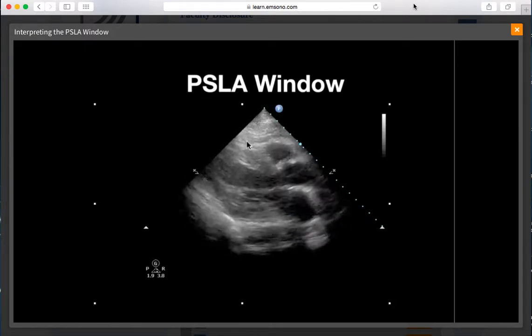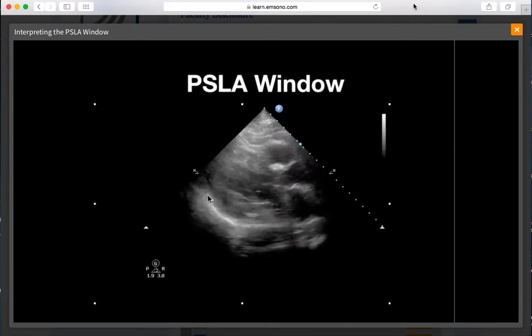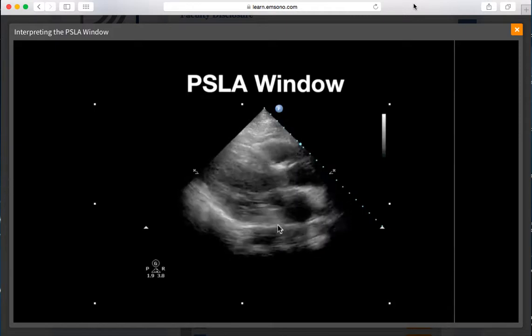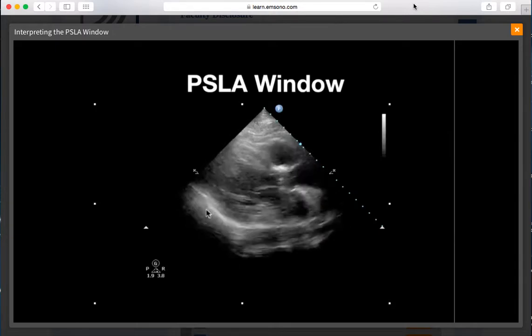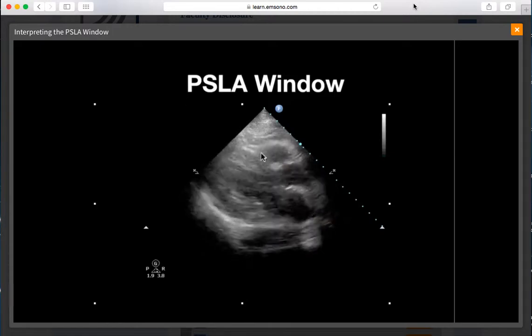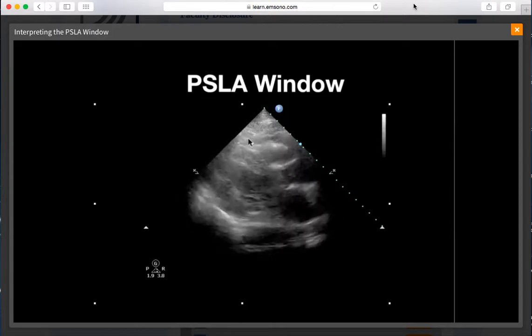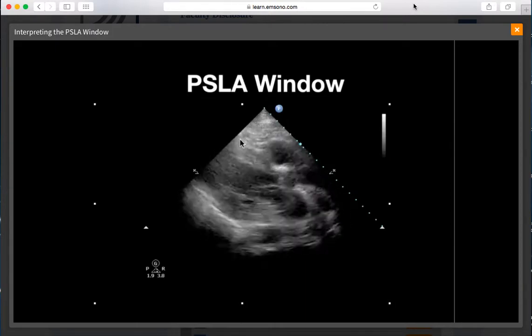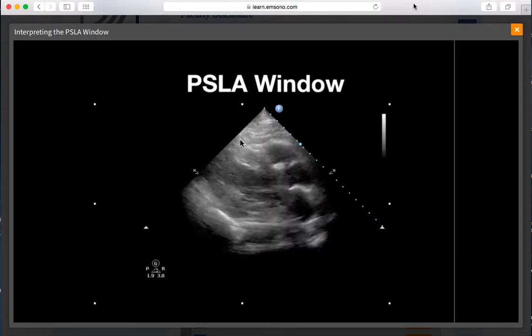There's echoes contained within it, but if we follow along towards the back wall of the left ventricle, we do not see any evidence of free fluid in the pericardial space, and we do not see a left pleural effusion either. So the fact that you have this echogenic area just anteriorly in this supine patient would make it very unlikely that this represented a pericardial effusion.